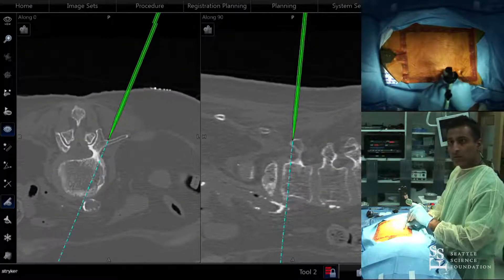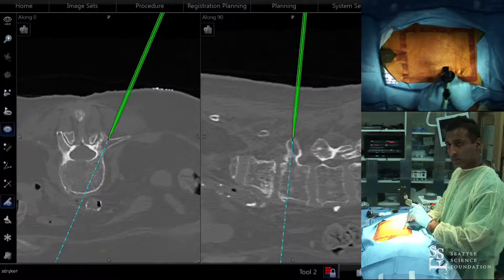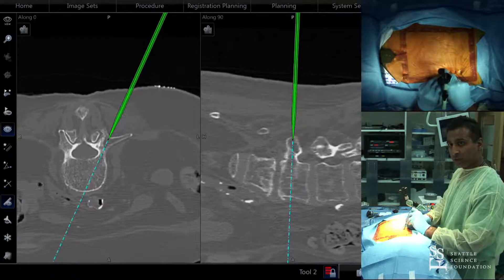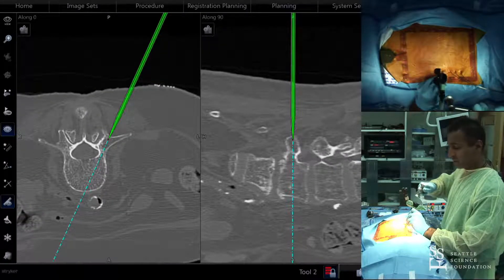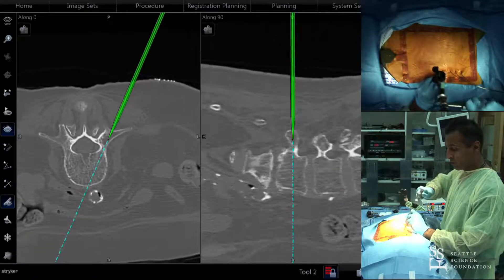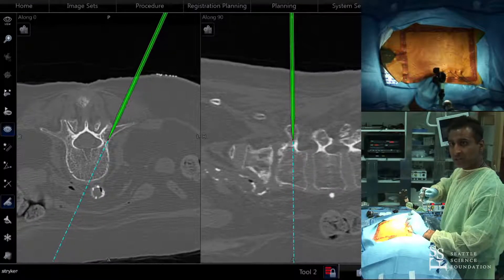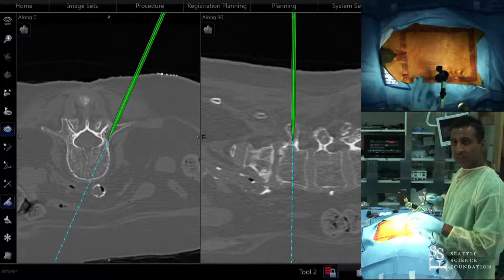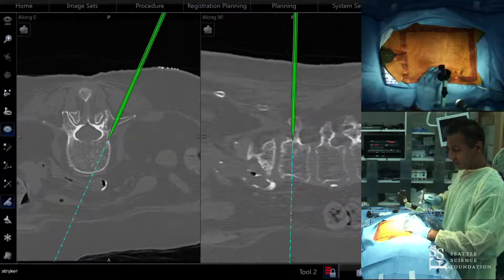There is a technique where you can place into the pedicle and lock it without using a guide wire. Every now and again I'll change my steps. When I was doing fluoro-based TLIFs, I always put the guide wires in first, then dropped my tube, did the TLIF, and then came back for screws. I maintain that same order for navigation. But with navigation, it's pretty easy to do the TLIF first and then come back.